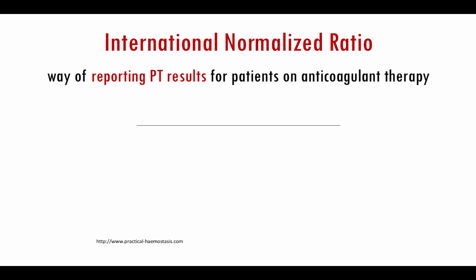And so let's say I'm in Houghton, I get my PT done, and it's reading 13.2, and then I have that exact same day, I somehow end up in Denver, and I have my PT done, and it's reading 15.5. Now, they may not actually have been changed. I may not have actually elongated my PT by 2 seconds.